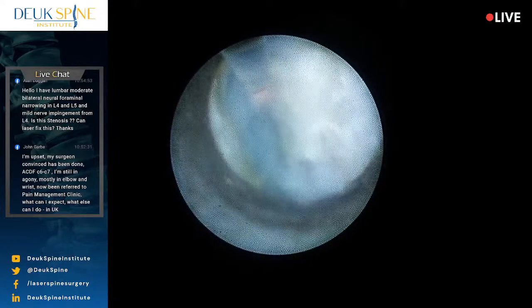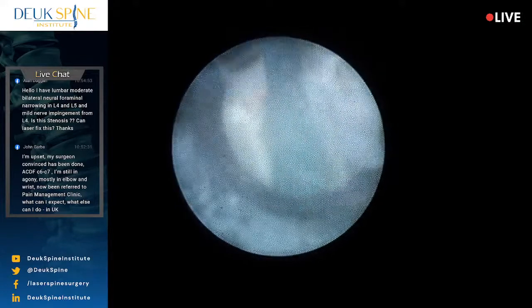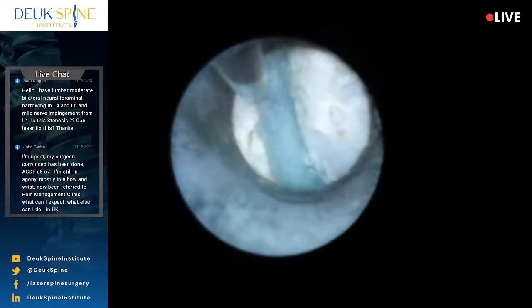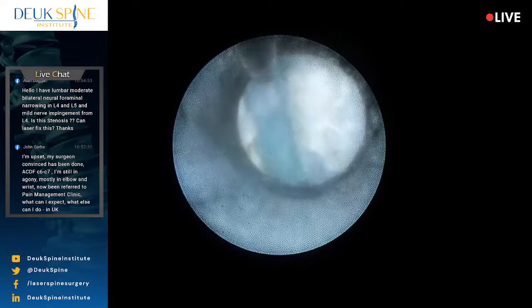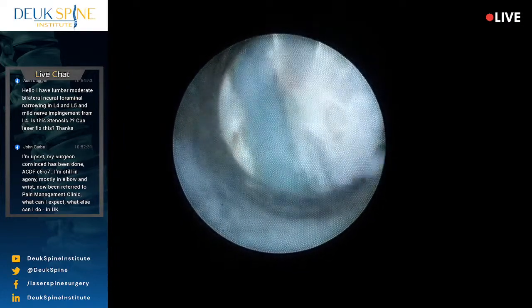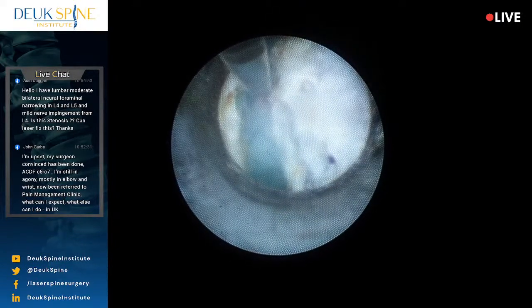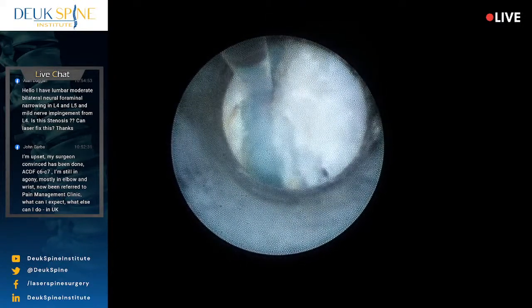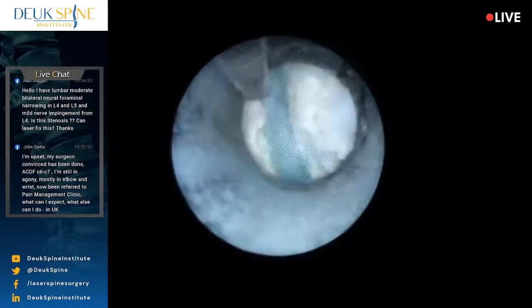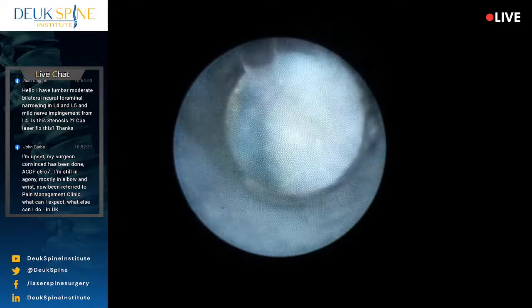If you do that properly, you won't destroy your scopes, and you won't have to be repairing them every week, because repairs will drive you out of business. It's no joke. The repairs are very expensive. The scopes are very expensive, and the repairs are very expensive, but more importantly, you don't have a scope while it's being repaired, so it puts you out of business for a while.